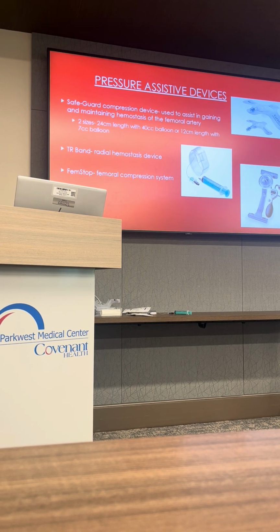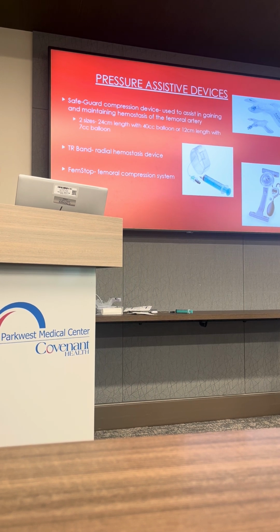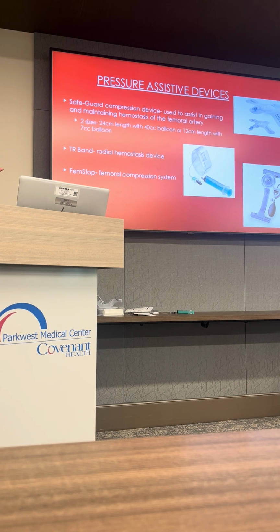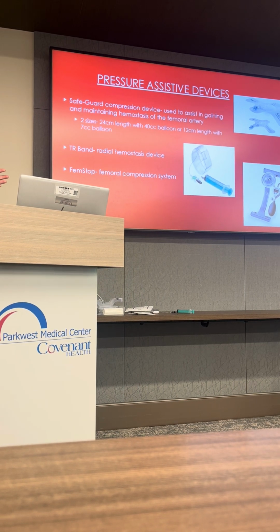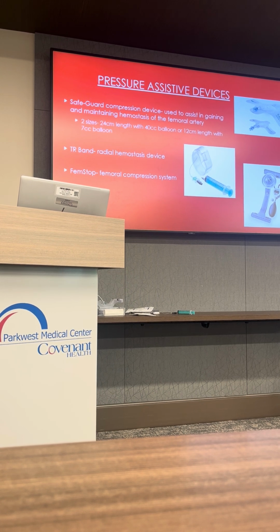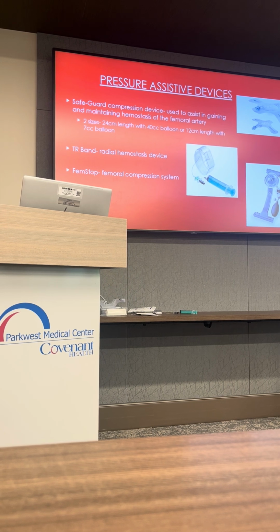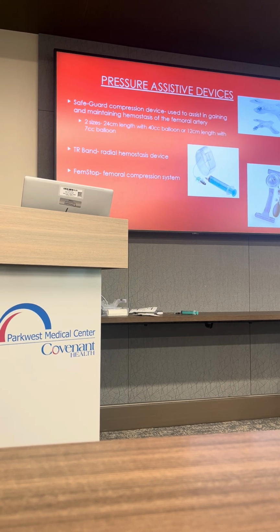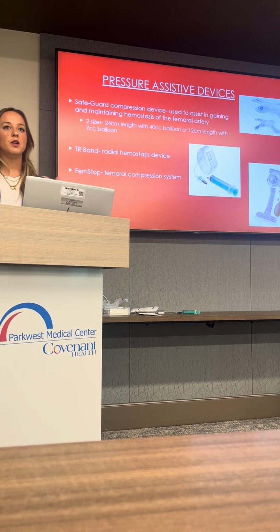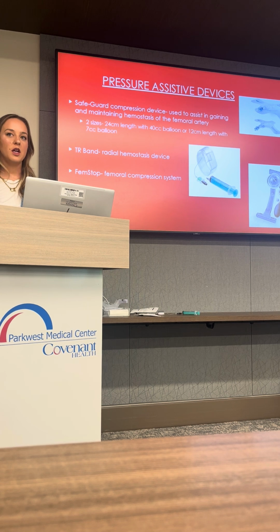The other thing I will mention, because I've seen it a few times, as a bedside nurse, there were times where we would have an RP in place, and a femstop would be used to help hold pressure for oozing around that site. As Dr. Negrado and Dr. Rahman already mentioned, this is something you need to call the provider about before you throw something like that on. With the RPs, with the peel away sheath, too much pressure can cause that to be impaired and can cause further issues.